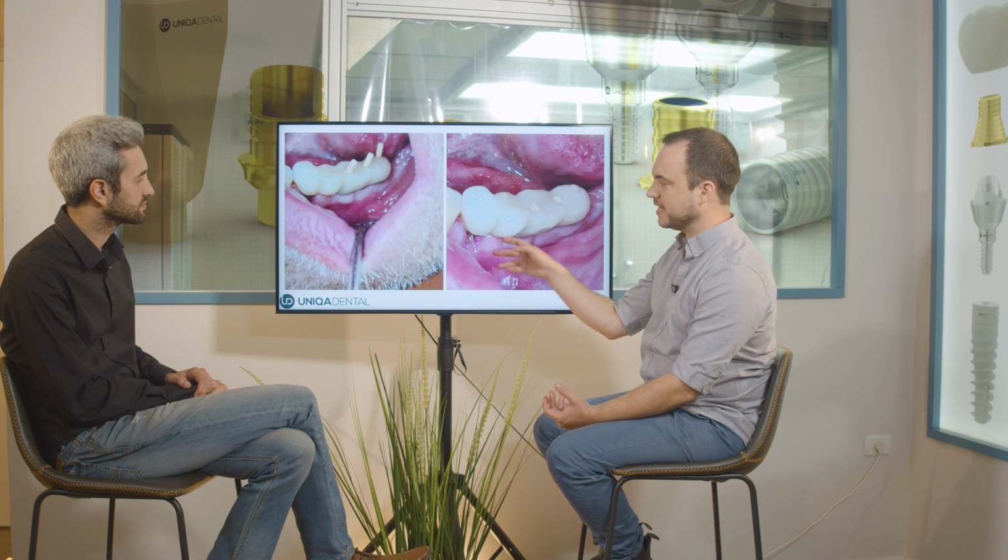So what we want to get at the end of the healing process is that the gingiva will get some part of the bridge. It will look like you have an emergence profile. So it will grow around it? Yeah, the gingiva will grow around the teeth and it will look like you have some kind of emergence profile. The crown comes out of the gingiva. This is the provisional bridge. Yeah. When do you plan to switch it to zirconia, the final restoration?